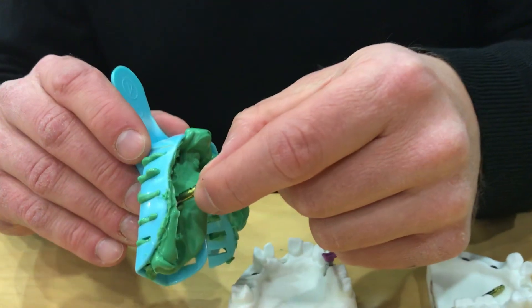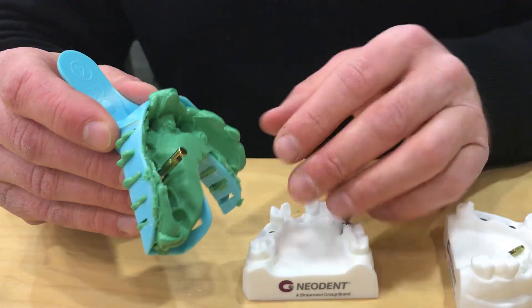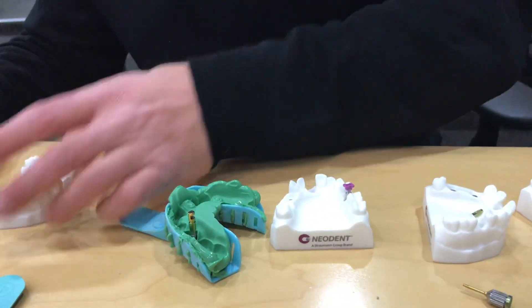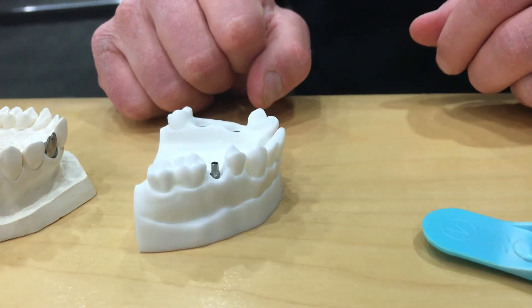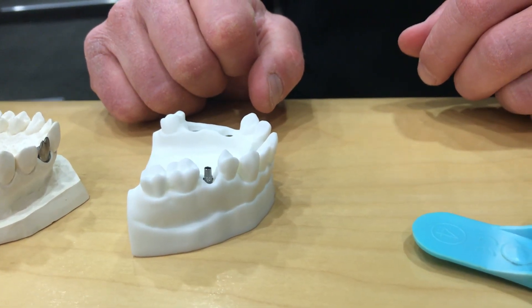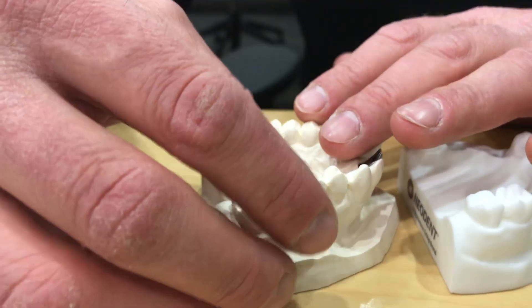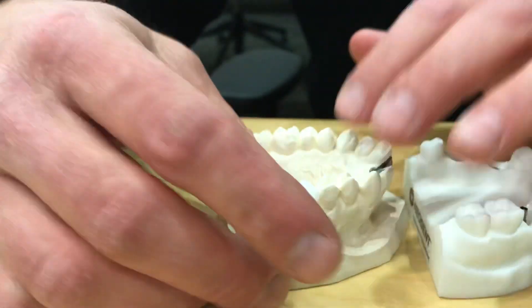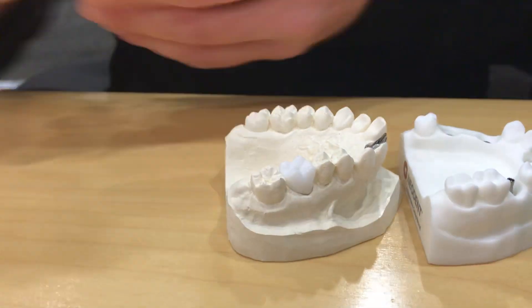When we transfer that information with our impression coping and attach our analog, we press this back into our impression and send it off to the lab. We'll obviously need the opposing, a bite, and a shade. We'll typically wait about two weeks and decide on a restoration — such as a ti-base abutment, a titanium base. It's a stock component used by the laboratory, and they can reverse engineer a zirconia crown — in this case a monolithic. They would touch the crown up and lute the two pieces together. There's a screw access hole in the top, and they'll deliver this one-piece solution in the posterior with the abutment and crown glued together.